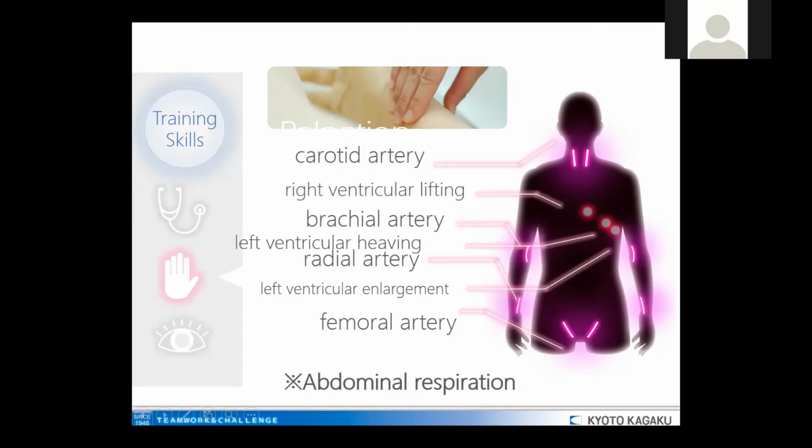And the point here is that those pulses, of course, are synchronized with the cardiology sounds, with the heart sounds, and with the heart rate, of course, so that the students can take the pulse as a reference point to understand the sounds that they are hearing with their stethoscope. So actually, heart sounds and pulse are things that go together.